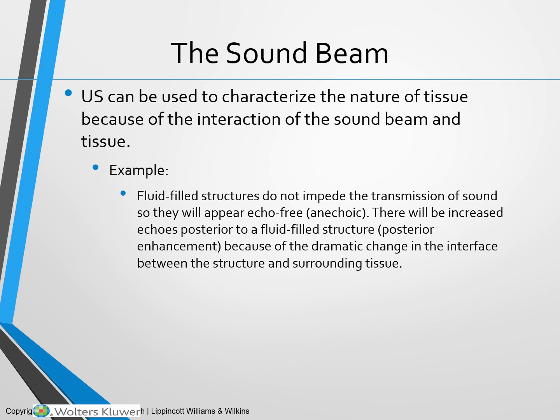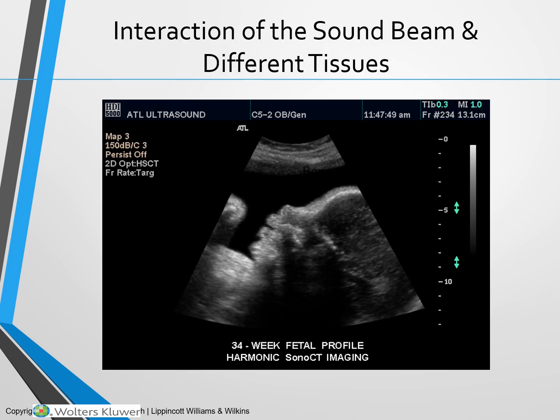There will be increased echoes posterior then to a fluid-filled structure, which we term posterior enhancement. The sound is enhanced posterior to that structure. This is because of the dramatic change in the interface between the structure and the surrounding tissues.